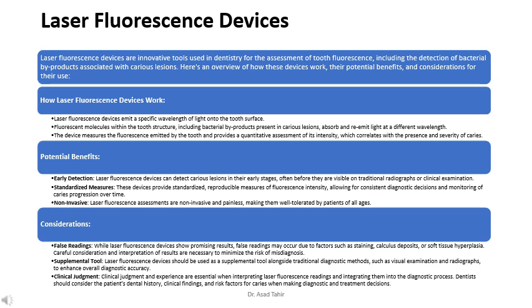Considerations. False readings. While laser fluorescence devices show promising results, false readings may occur due to factors such as staining, calculus deposits, or soft tissue hyperplasia. Careful consideration and interpretation of results are necessary to minimize the risk of misdiagnosis.